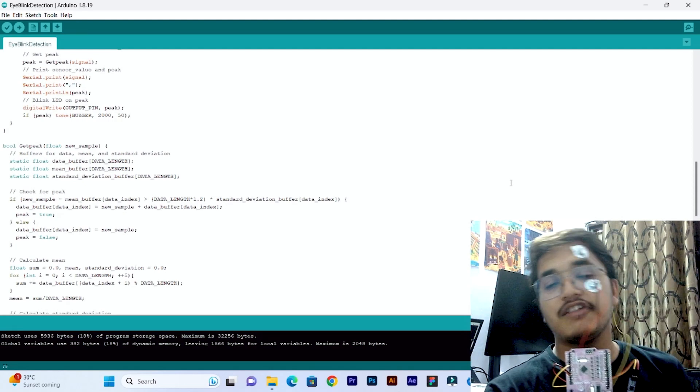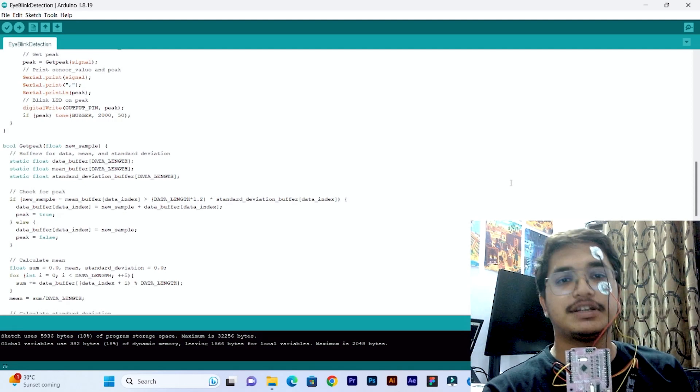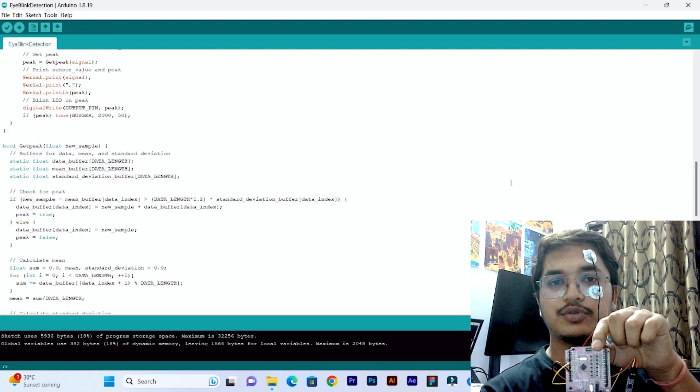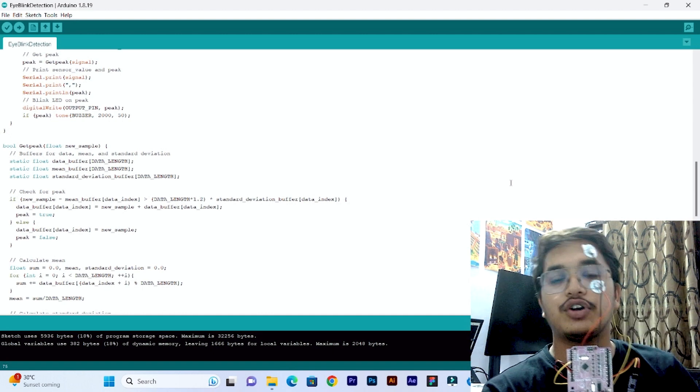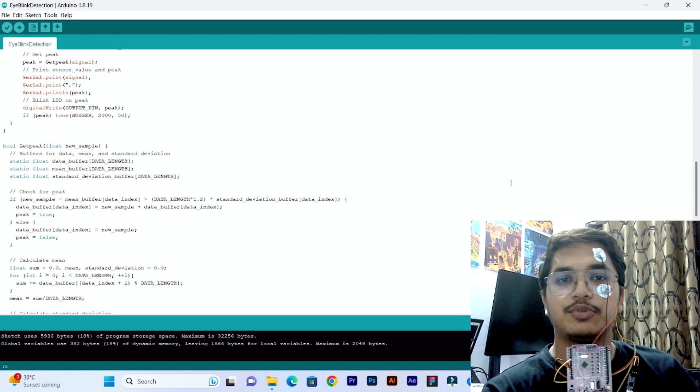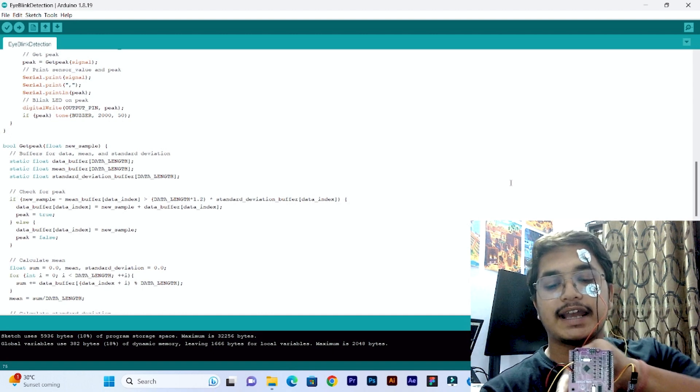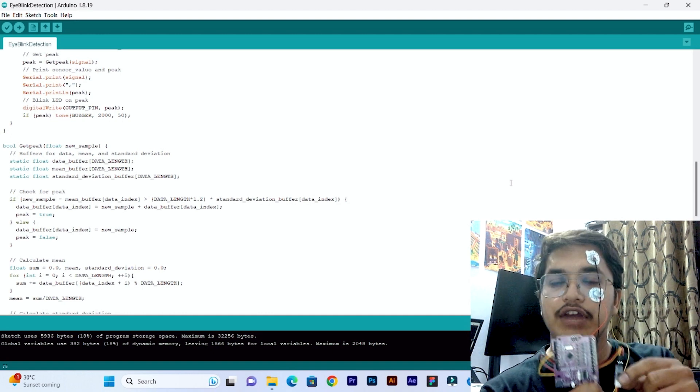Hi everyone, today we have made this blink detection project in which we are using Makeruno, which is an Arduino compatible board with onboard LEDs and a buzzer.